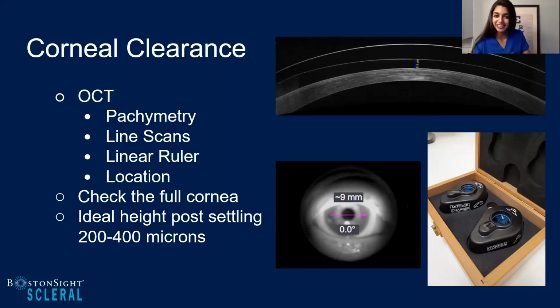That's a tough question to answer because nowadays there are so many different philosophies. When I first started fitting sclerals, it used to be about 3/4 to 1 of the thickness of my diagnostic lens. And there's a great study by Mashad that looks at combining the tear meniscus height and the central corneal thickness, and using the 150 microns and the 250 lens thickness to balance and optimize oxygen permeability.